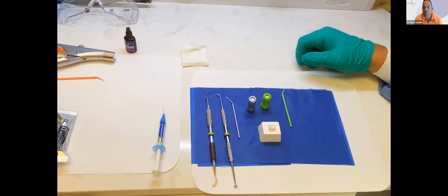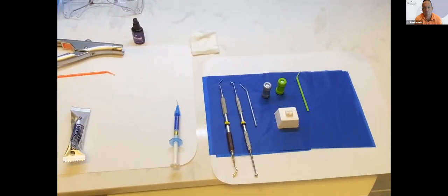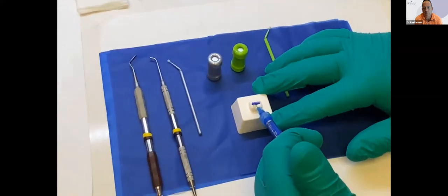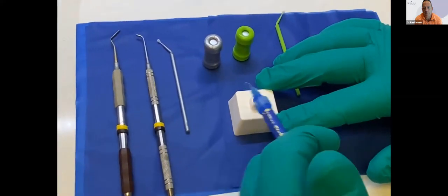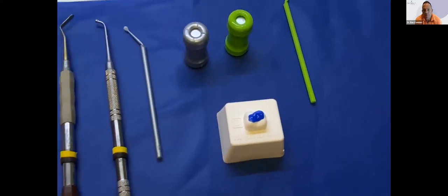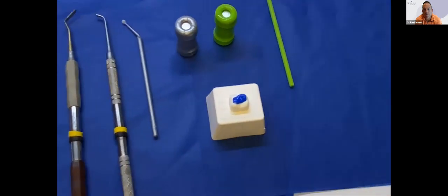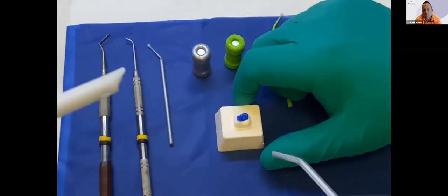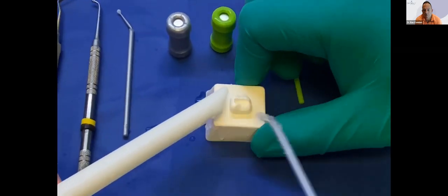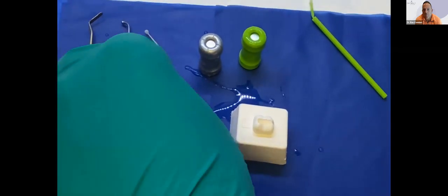for the potassium iodide. The first thing we're going to do is total etch the preparation for a short period of time. Literally, we don't need much more than 8 seconds or so. I'm going to leave that on for 8 to 10 seconds. While that's setting, I'll have my assistant grab her suction, and I'm going to rinse it off. I'm going to dry it thoroughly, and now I'm going to place my silver fluoride.